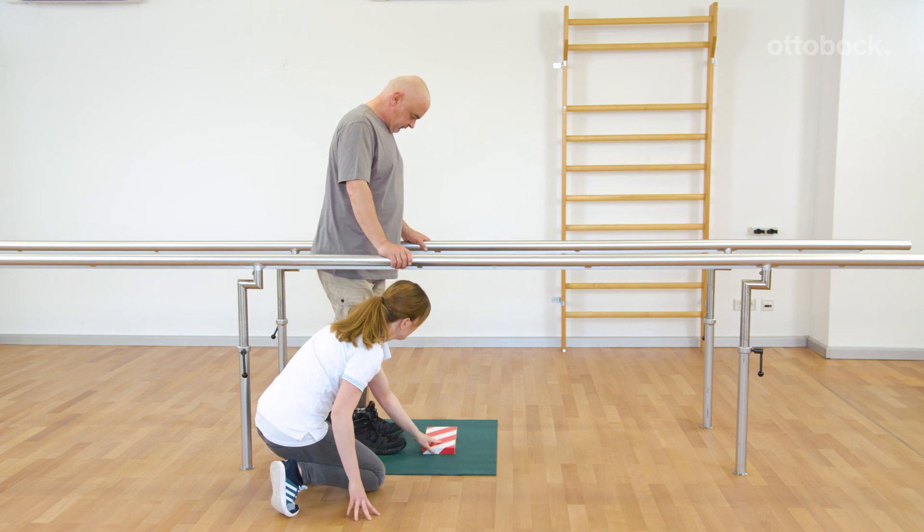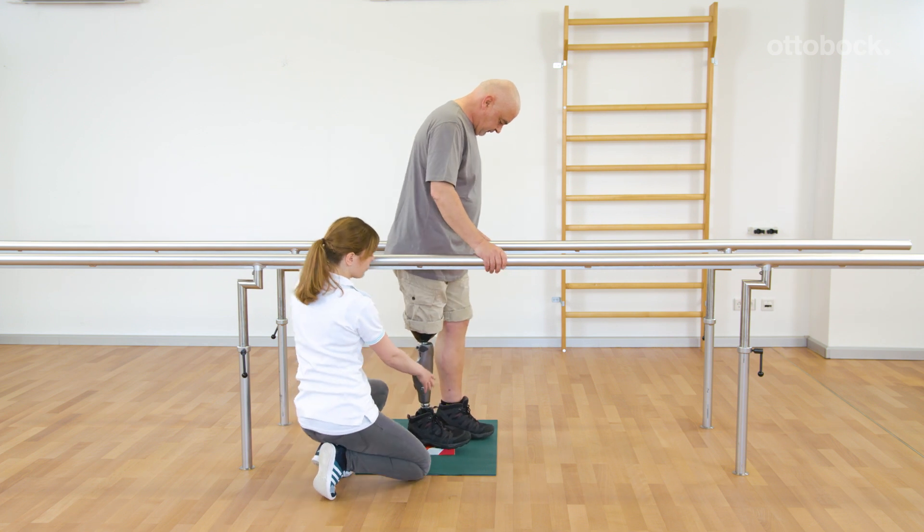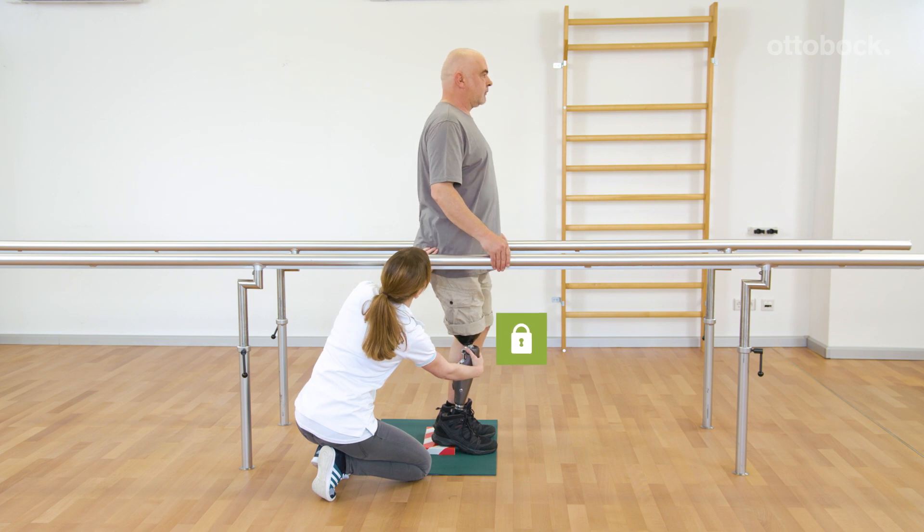Using a wooden plank, Franziska simulates standing on a slope or uneven ground. The intuitive stance function enables even loading of both legs with full foot contact.